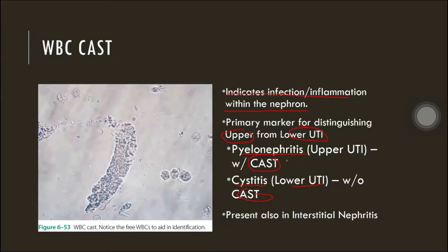So ano na yung mga dapat nyo i-take note with pyelonephritis? Okay, so kanina yung mga nabanggit, WBC, okay, and WBC cast, as well, of course, presence of bacteria. For cystitis, presence naman ng bacteria, okay, presence ng WBC, but take note, walang cast dapat, okay, dapat walang cast.